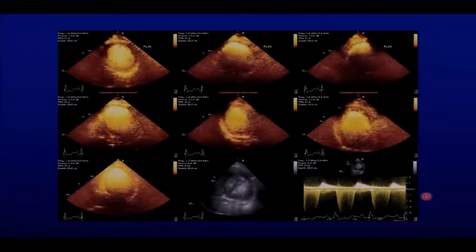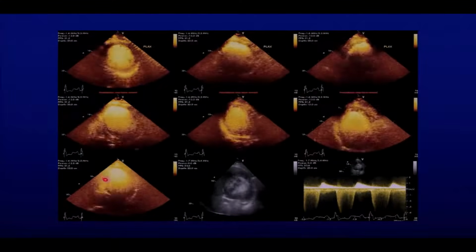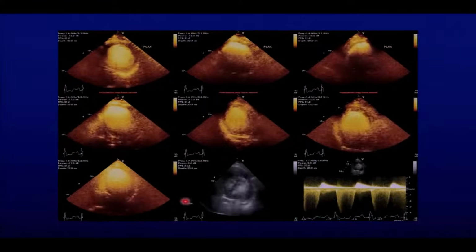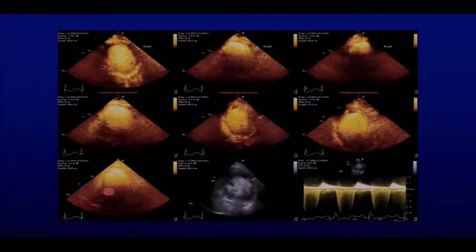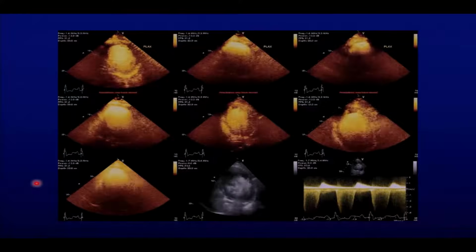All right. After what we went through, tell me what you see from a technical point of view in this image. Can you analyze these 2 images below? What is this image and what is this image? High MI, where? This one. High MI, and this one? Too much contrast. So what did they do? You know what they did? These are sequential.